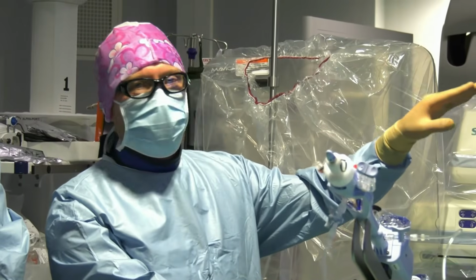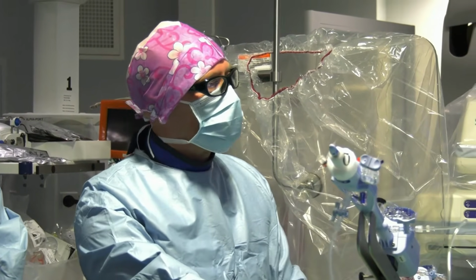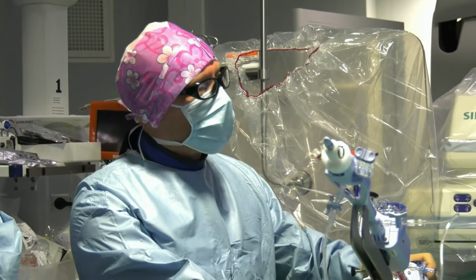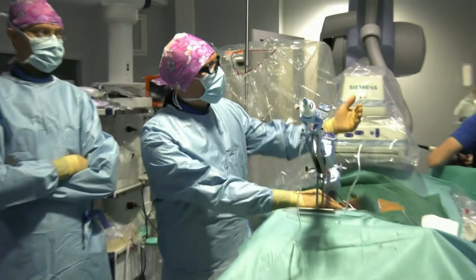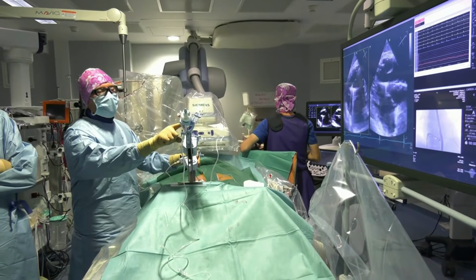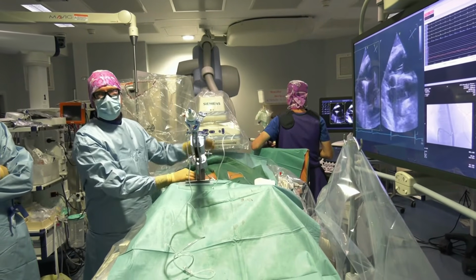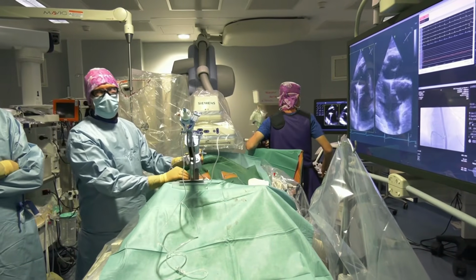As Erwan explained to you, we are just in the center of the valve, and we would like to go more in the aortic direction. So I have to push the whole system if I want to go more aortic, and I can turn the guide clockwise if I want to go more septal, or counterclockwise if I want to go more in the anterior direction. And last, with the delivery catheter handle, we will turn it clockwise or counterclockwise in order to have the proper orientation of the clip, to make sure that it's well perpendicular to both the septal and the anterior leaflet.